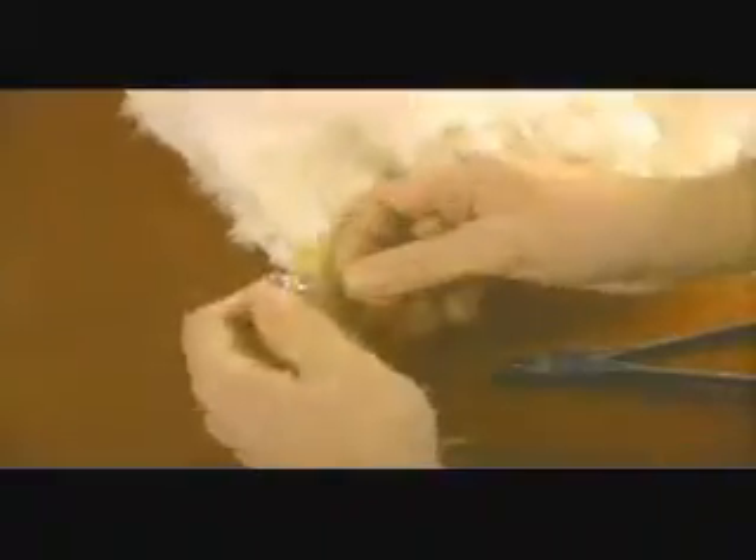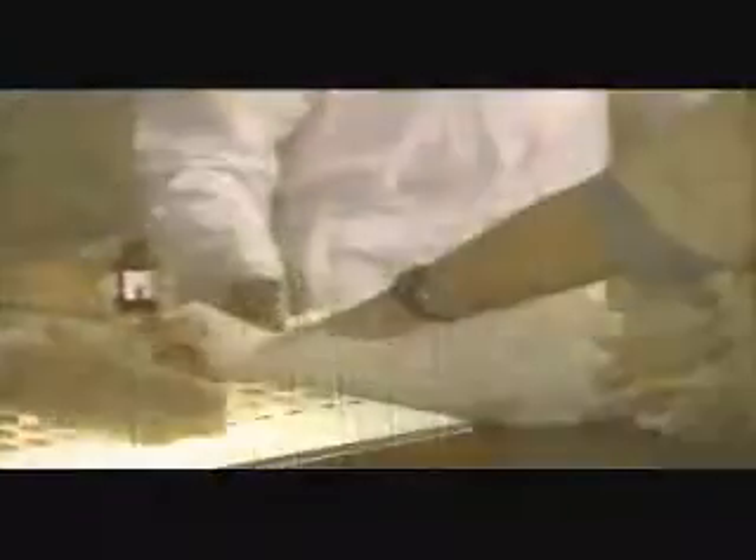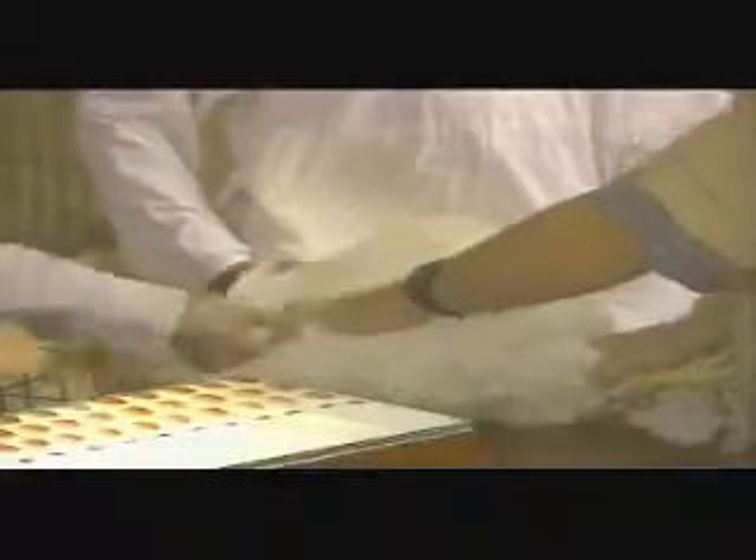In the event of a positive test result, it's crucial that the reacting bird be banded to identify it as a possible carrier of Pullorum-Typhoid, then immediately placed in a coop for additional testing or necropsy. However, a positive test result doesn't always mean a bird is infected with Pullorum-Typhoid.